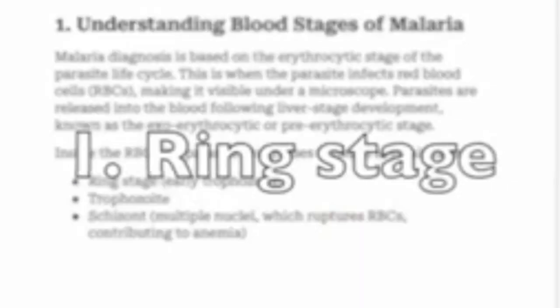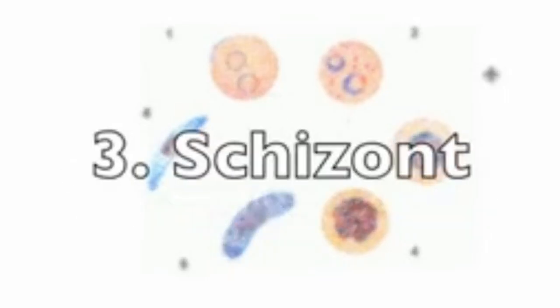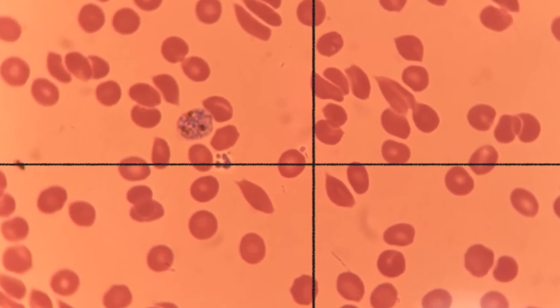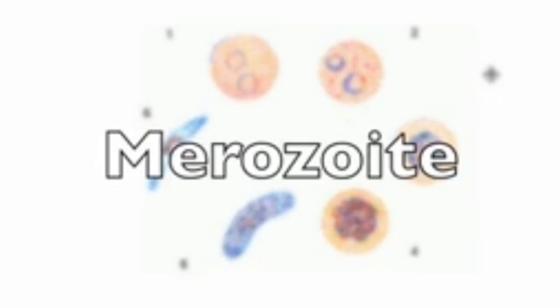So there's the early ring stage, which may also be referred to as the early trophozoite. There's the trophozoite proper stage. Then there's the schizont, which has multiple nuclei. And this is the stage that ruptures to release more parasites. And it's in the form, at this point, when it's released, it's a merozoite. And so it's all this rupturing, keep in mind, that causes anemia of the patient. So here's a visual of the stages that it goes through.